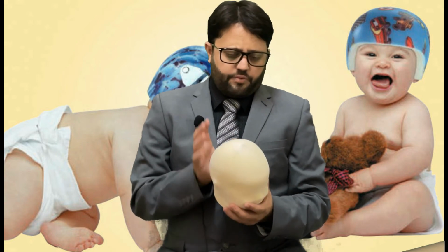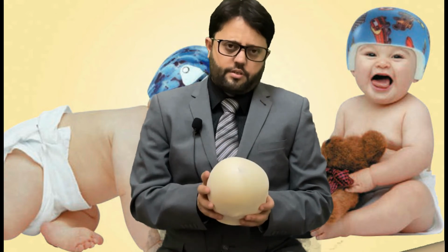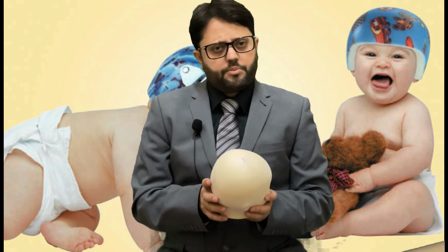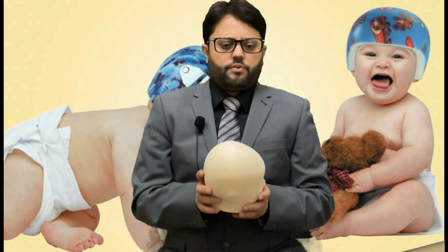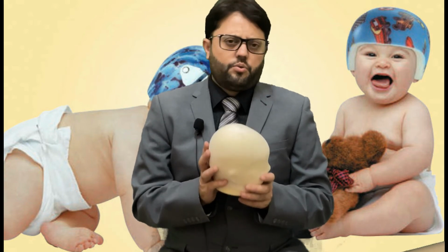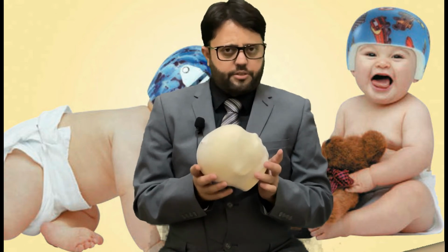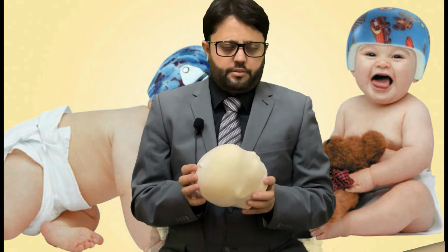Once the patient is here, we have many things to do stepwise. We need to see first the age of the patient, whether he was premature, or whether he has some severity, whether it is really more severe. So before starting a cranial remolding orthosis, we have to first do repositioning. For repositioning, we need to place the baby in such a position that the flat area of the head does not take the weight of the body.